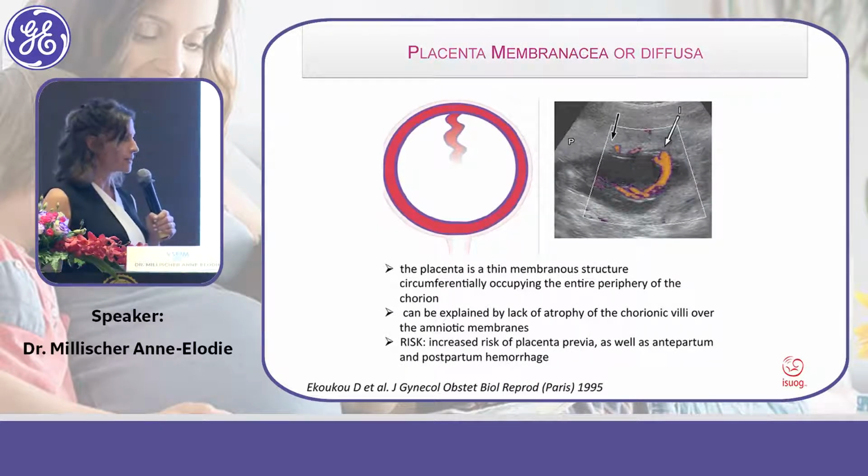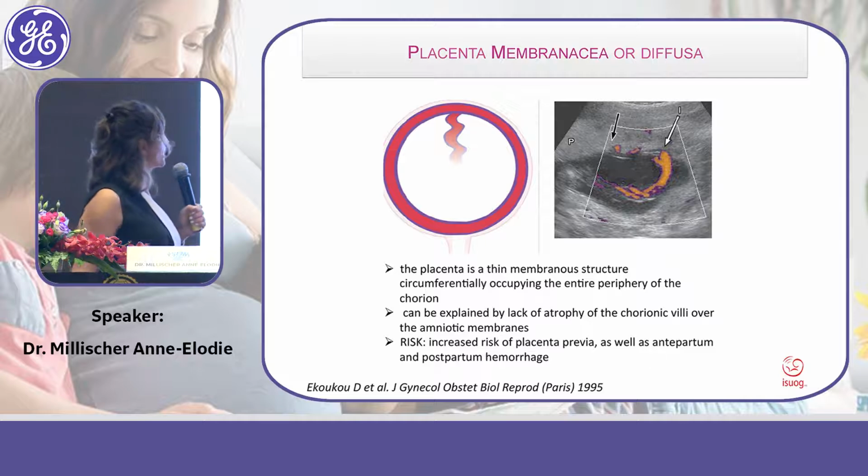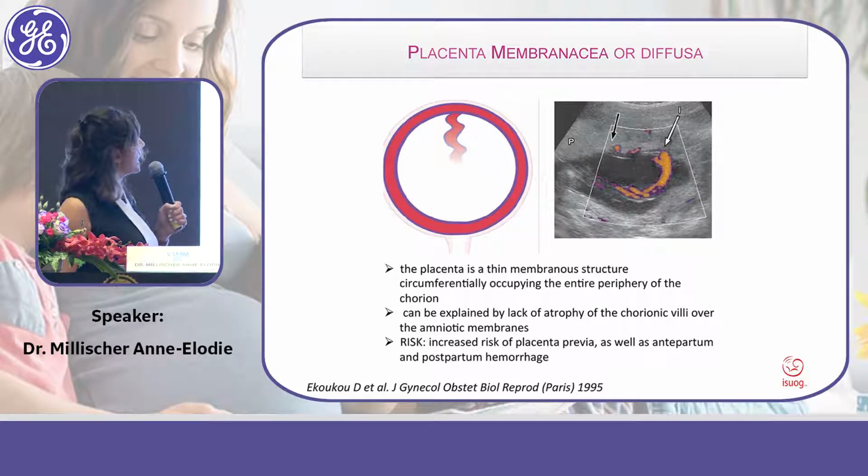The last aspect that we have to know is the membranacea or diffusa placenta.